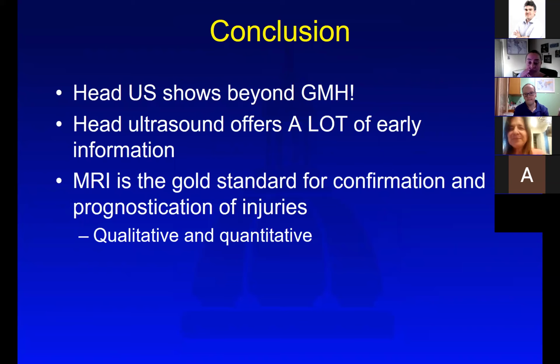That's a great question. I personally do not encourage ultrasound for trauma cases either. One, the assessment of fracture is limited to superficial small hemorrhages. I think the detection rate would be limited. For head trauma, we combine triplanar HASTE with diffusion, black bone imaging, and SWI.